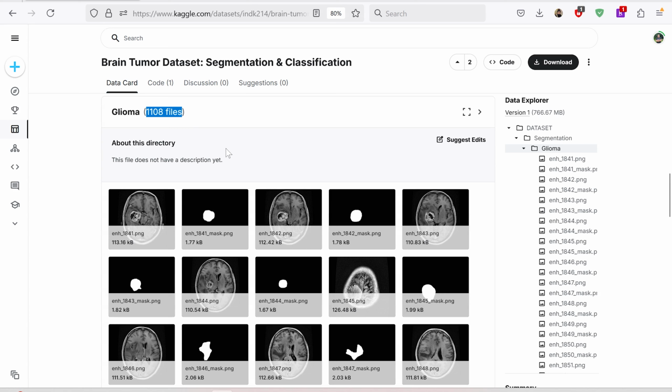So simply, if we can get this image and the corresponding mask using scripts so that we can bitwise and both of them together so that we can gain that ROI, and based on that ROI we can apply cropping so that we can get the cropped ROI and we can extract the different features from that one.